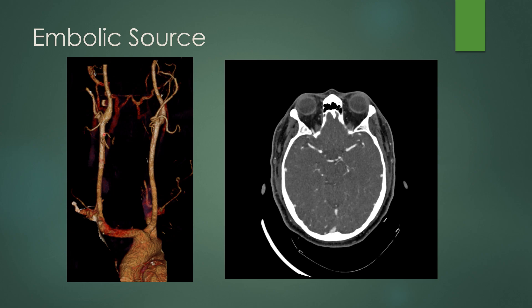On vascular imaging, the neck vessels are widely patent with no stenosis or clot narrowing in any intracranial vessels, so this was a cardioembolic source. However, you can get the same appearance with vasculitis causing peripheral infarcts, or you can see embolic clots if they are large enough and occlude vessels at a more proximal location.